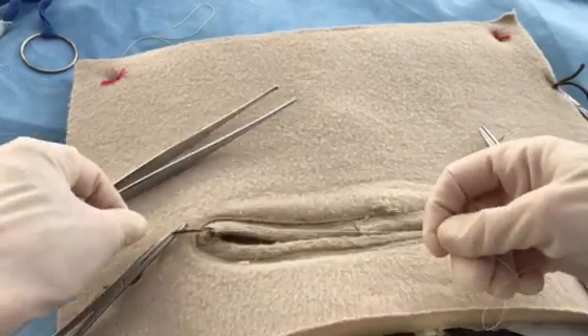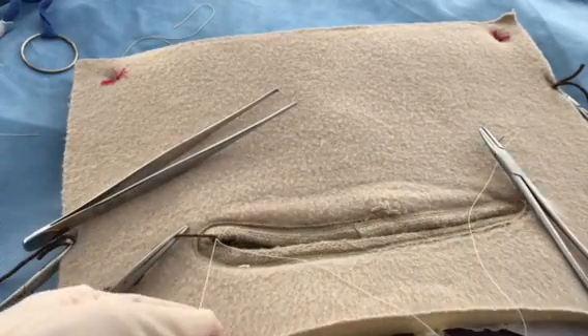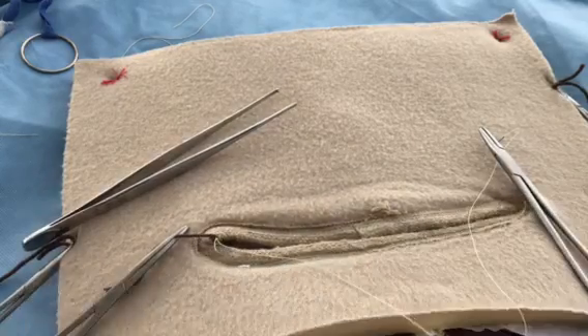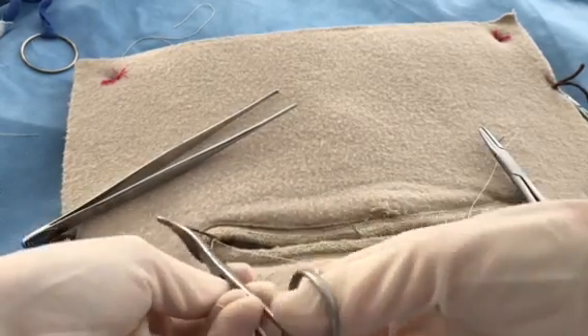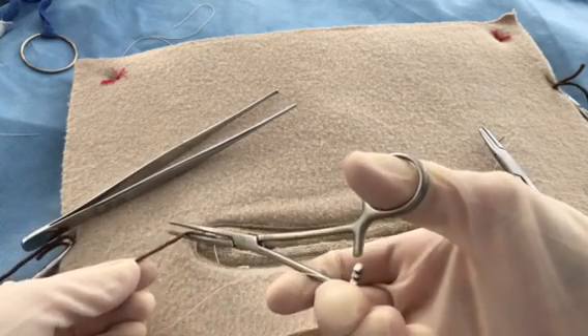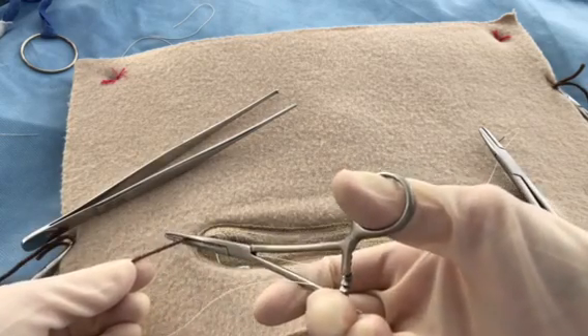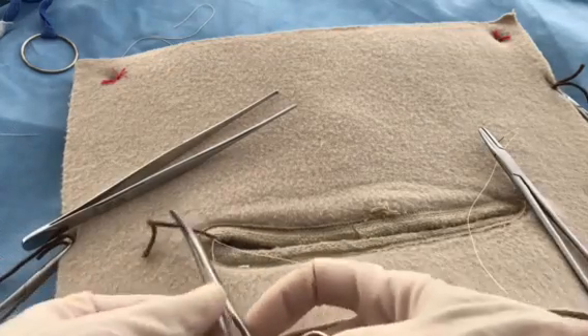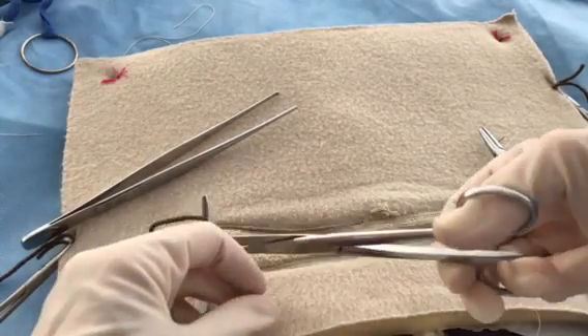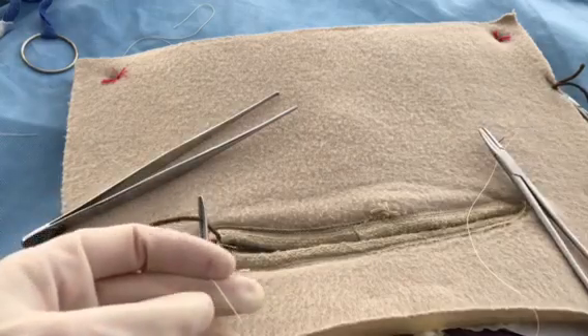Quite often what will happen is the vessel will be flashed, which means the clamp is released. You look for any flash of bleeding and it is reapplied. In that case, a second suture will then be tied around it because these are critical vessels.